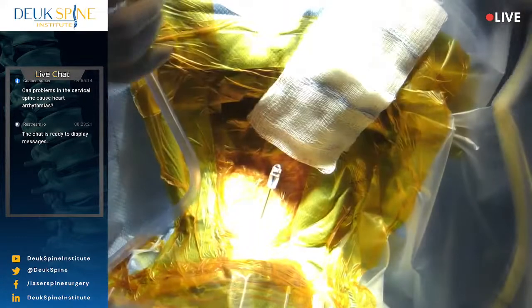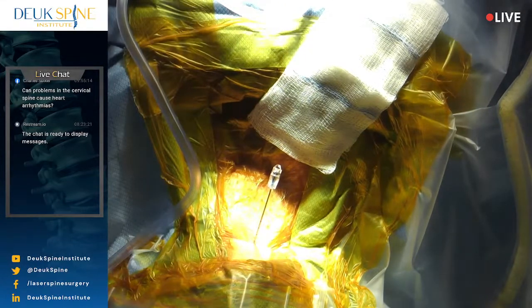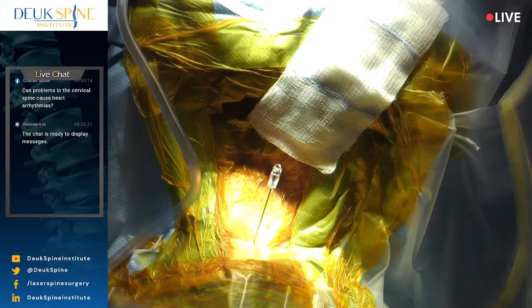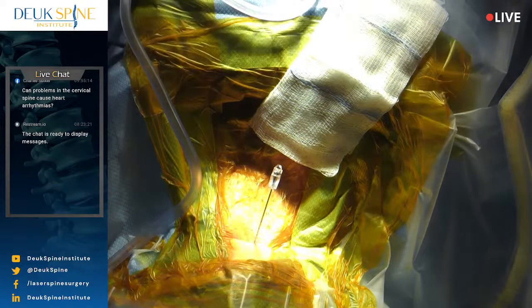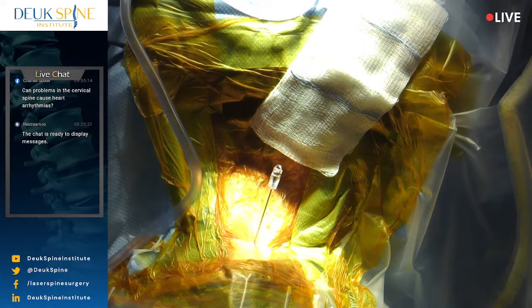All right. So in that case, we can rotate the scope better. Or no, we want to put 2 needles. I think we should do that first, and then we work on the other one. What do you think? All right. Let's do it. So Luis is suggesting we just start with one and then we go to the other. Just make sure you remind me to do the other one. I think it's not a bad idea.